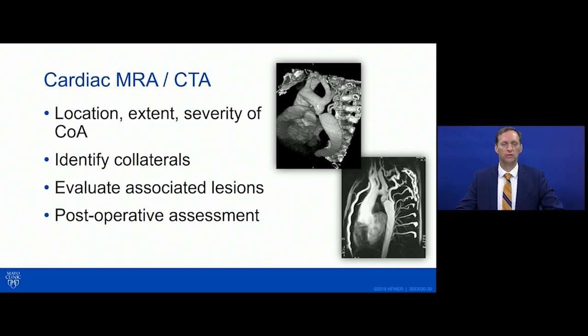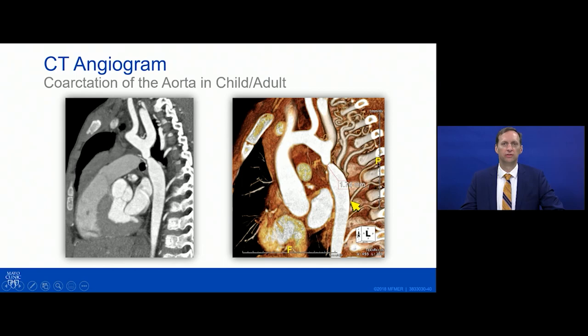Here's another CT angiogram — an approximately 11-year-old child with a severe coarctation measuring about two millimeters, with large intercostal and vertebral arteries acting as collaterals to the descending aorta.